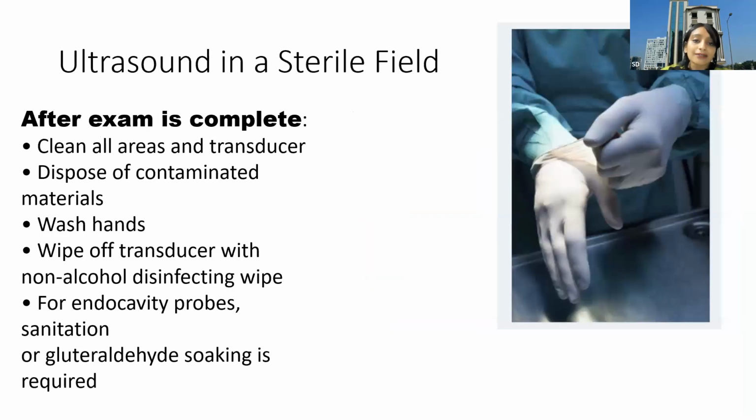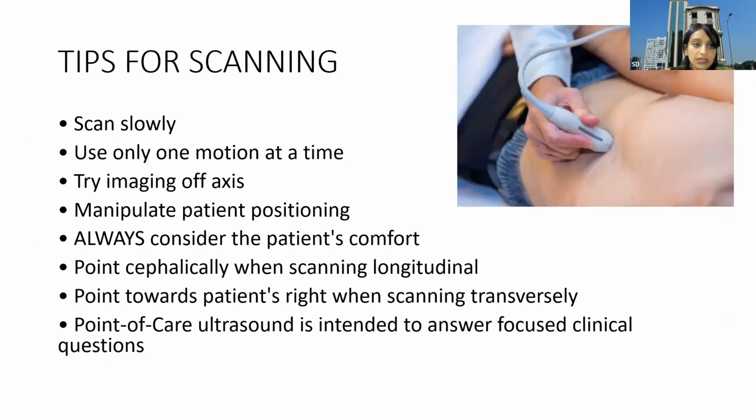The ultrasound should be used in a sterile field. Before using the ultrasound, the entire patient area, the skin, should be cleaned, and strict aseptic precautions should be followed. We should keep in mind that the ultrasound probe should be covered with a sterile cover, and in no way should there be chances of infection.